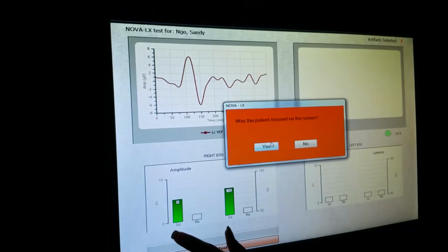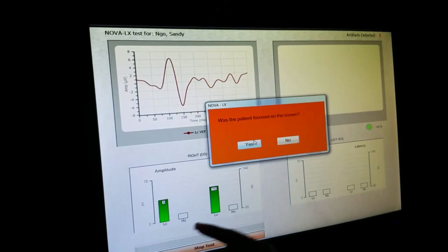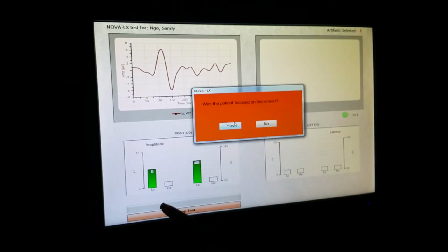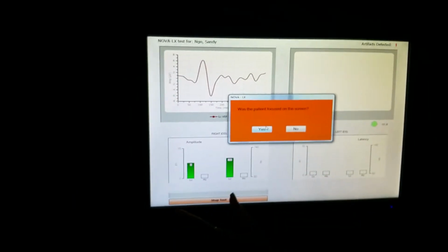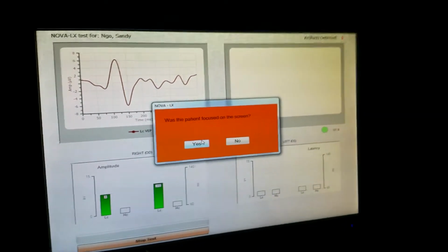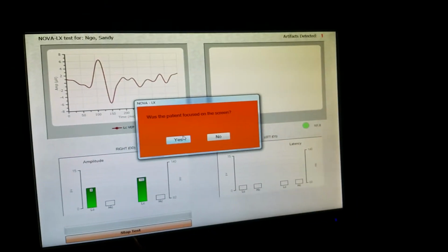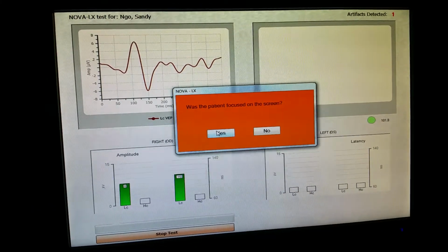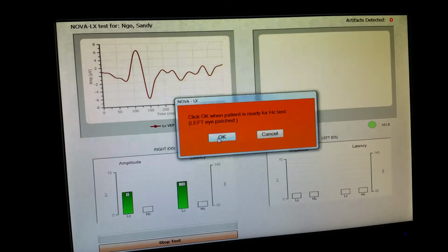Okay, so the very first test that we do is low contrast, which is looking at peripheral vision. So you see here we have these green bars, right? Low contrast is pretty smart. Whenever it pops up and says, was the patient focused on the screen, you can always say yes. Because it knows if we get a red reading or a white reading, it's going to say, let's just double check that and make sure that it's correct. It's not just a focusing issue. So it will tell you what to do. So we're going to say yes, and since she's nice and green, which is normal, we're going to move on to the high contrast test.